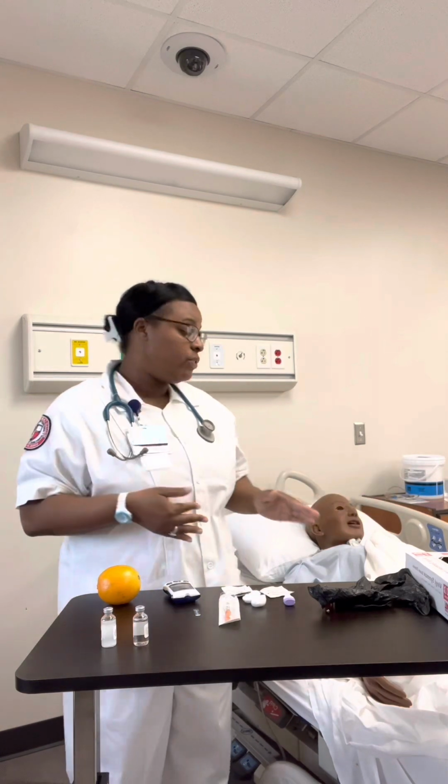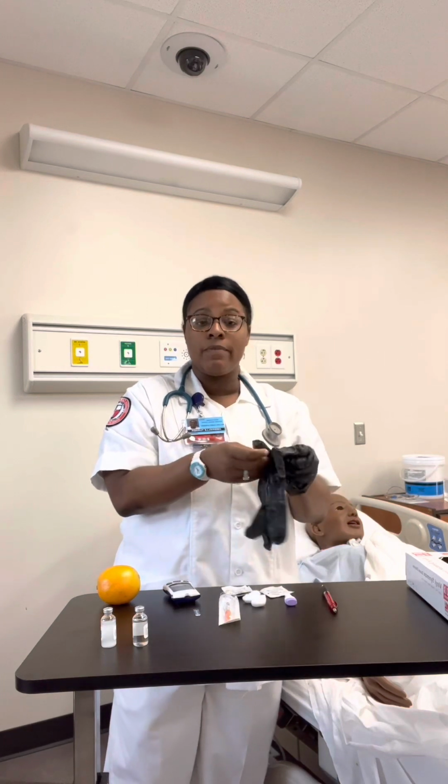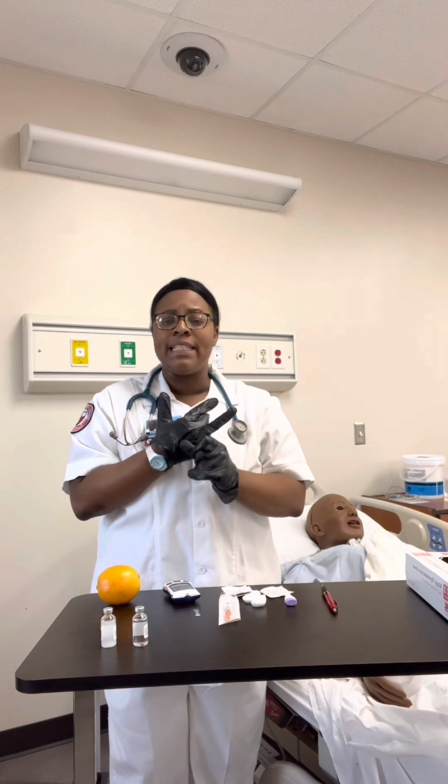So of course, I'm going to verify my physician's orders, identify my patient, perform hand hygiene, and don clean gloves. I'm going to compare my orders with the MAR. I'm going to perform a focused assessment, noting signs and symptoms of hyperglycemia. Signs and symptoms of hyperglycemia are polyuria, polydipsia, polyphagia. Signs and symptoms of hypoglycemia: diaphoresis, clammy skin, a feeling of being jittery, or confusion.